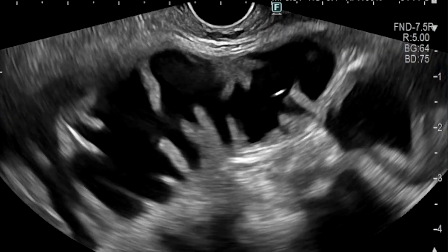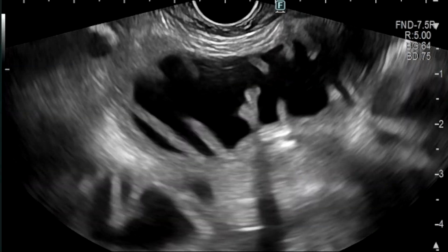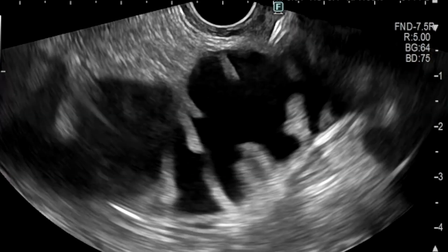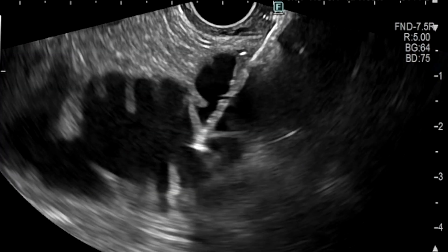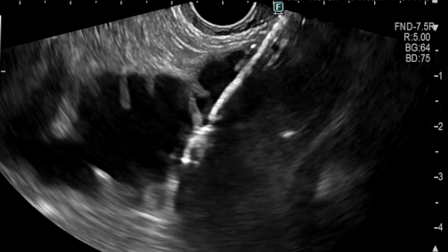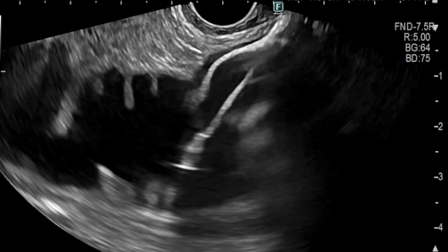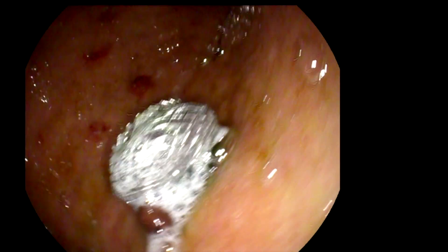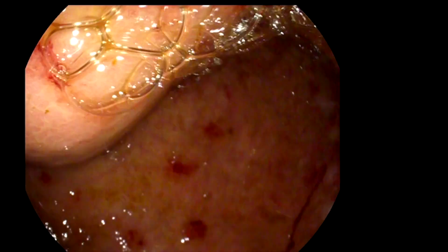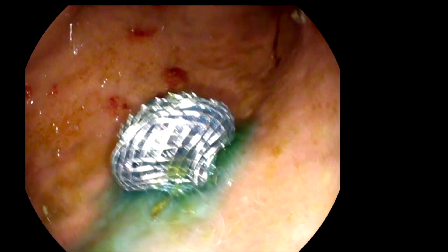With the tip of the echoendoscope placed within the gastric lumen, jejunal loops were identified. The tip of a 15mm diameter hot AXIOS lumen-apposing metal stent with a 10mm saddle length was then used to directly puncture the jejunal wall, with deployment of the distal flange within the jejunum followed by deployment of the proximal flange within the gastric lumen. At the end of the procedure, the position of the choledochoduodenostomy stent and the gastrojejunostomy stent was confirmed on fluoroscopy and endoscopy.